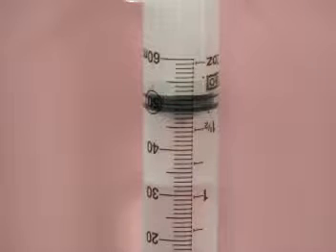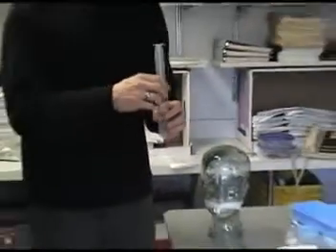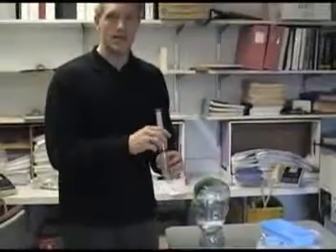The reason for this is the catheter has 2 to 3 cc's of hold-up volume in there, and what you want to do is clear out that catheter of saline and make sure that all the saline is in the lower lung so that when you aspirate back into your syringe, you've only saline in there that's touched the lower lung.